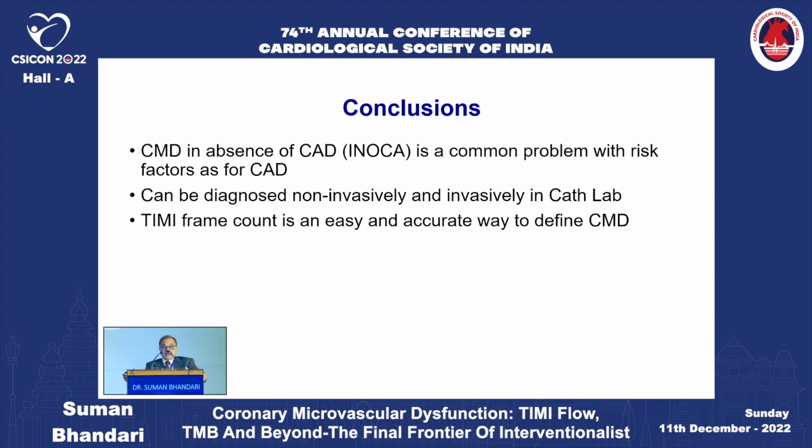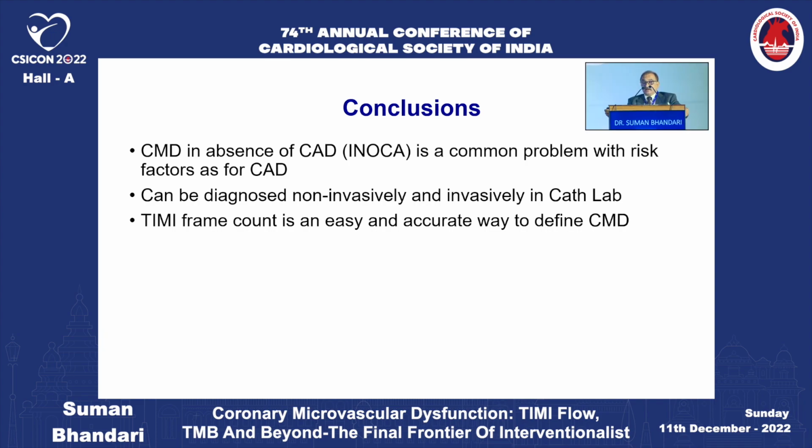And in conclusion, CMD in absence of CAD, which is termed INOCA, is a common problem with risk factors as for CAD. It can be diagnosed both non-invasively and invasively in the cath lab. A TIMI frame count is an easy and accurate way to define CMD.